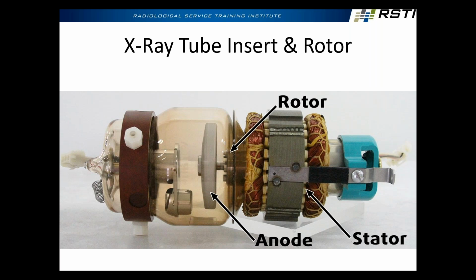We don't talk a whole lot about heel effect, or you probably haven't heard a whole lot about it, because in modern digital imaging, we calibrate it out of the image, all right? If you were to look at an actual film image, you could actually, in some cases, see the heel effect. You'd see the darkness of the film drop off as you move toward the heel.